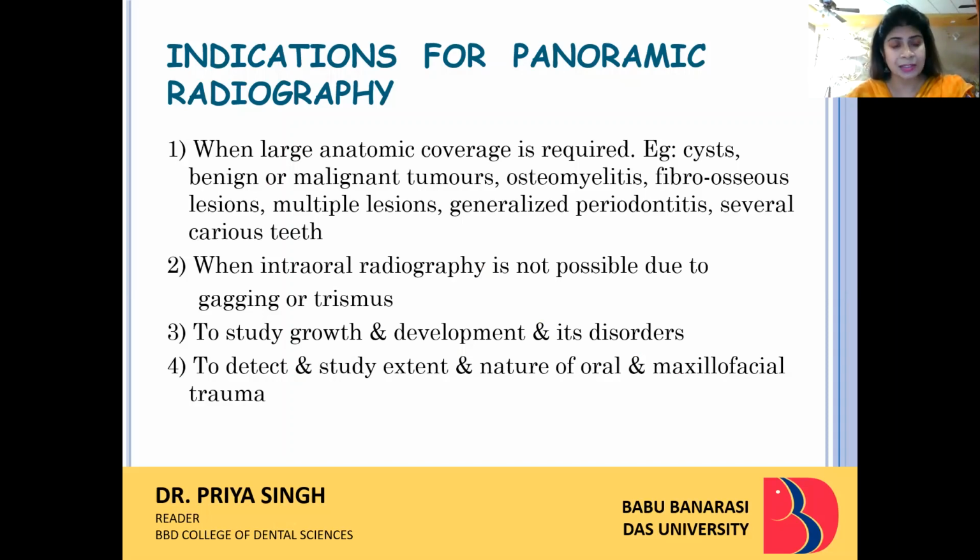In few cases, the patient might not be able to have an intraoral radiographic film inside the mouth because of gagging reflex. In such cases also, panoramic radiography will be very beneficial.